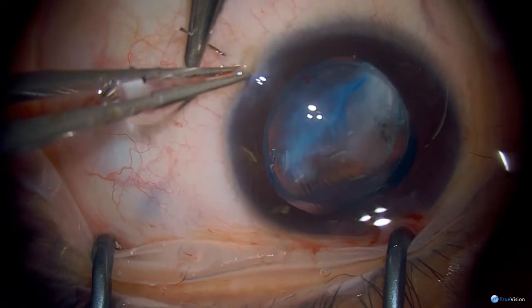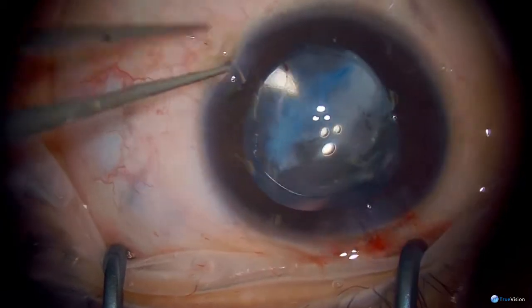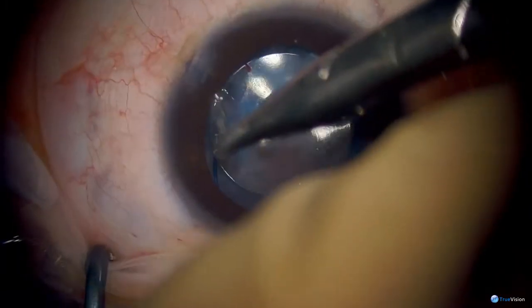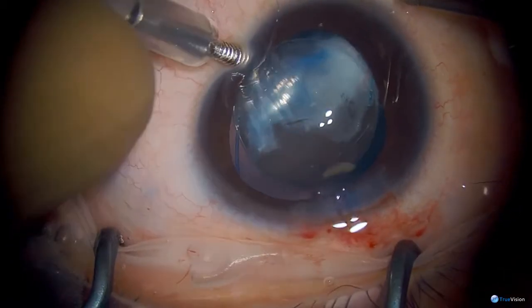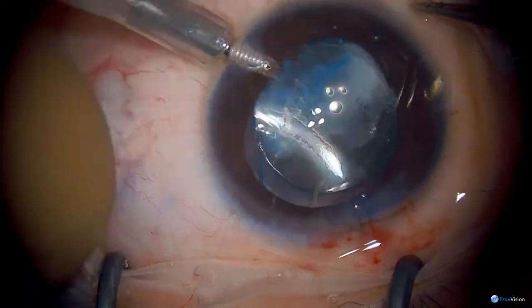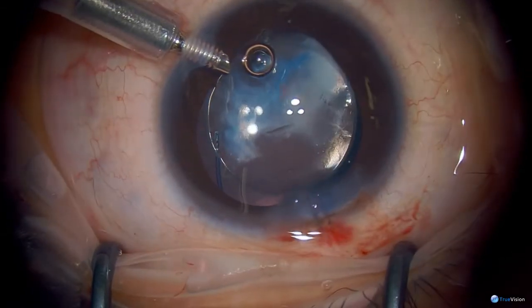Stitch at the infusion. Last time that got cut or pulled out, but this time we'll hopefully use that. Everything we're using is 10-0 Vicryl. I'm just going to keep this along so that's less likely to... Sometimes when you're pushing the infusion in, it gets pushed aside or gets cut.